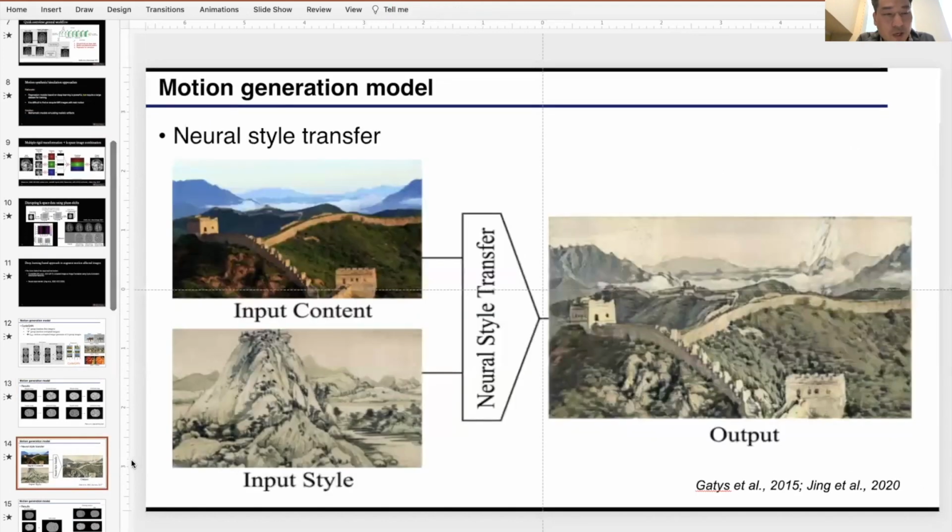So what we tried next was using a neural style transfer method. Here it's more of a feed-forward method where you use one input as content and the other one for style adding. Then the output would preserve the major portion of the data, but with a different style.